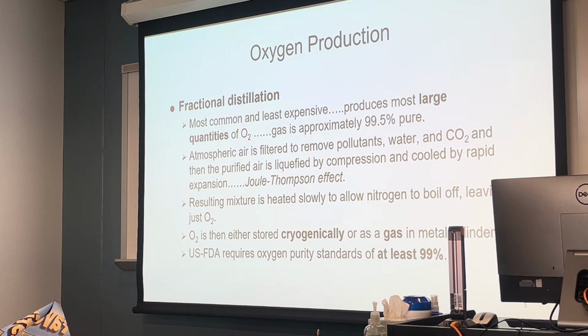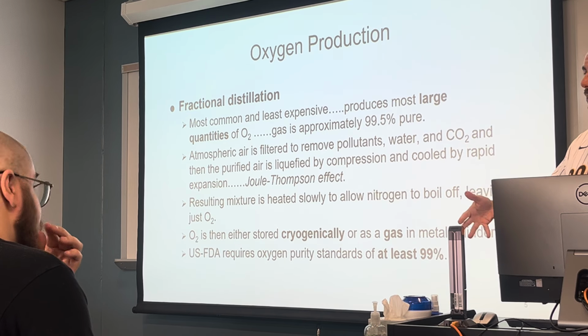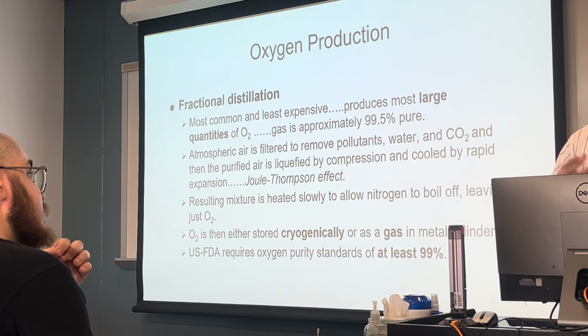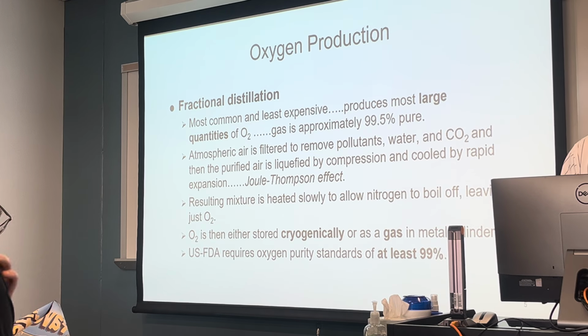Now, once we have this pure oxygen, 99.5% pure oxygen, it's going to be stored one of two ways. Either as a gas, that we could put maybe in an oxygen tank, or it can be stored cryogenically. When you hear that word cryogenically stored, what do you think of? Frozen, cold, absolutely. So oxygen can be stored as a liquid, cryogenically, at an extremely cold temperature.